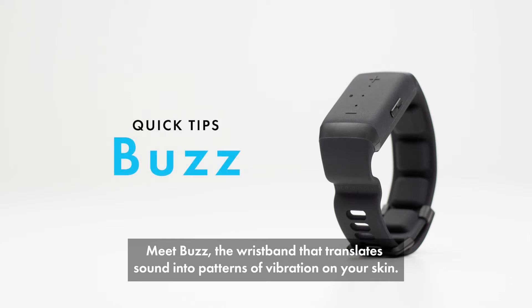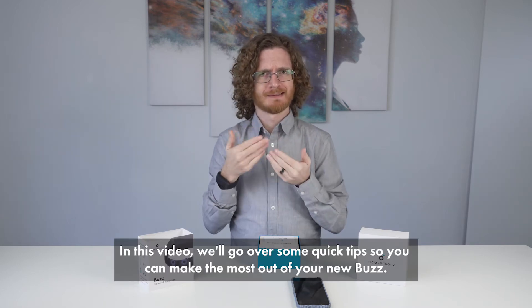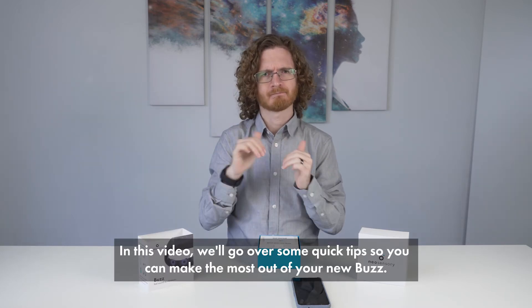Meet Buzz, the wristband that translates sound into patterns of vibration on your skin. In this video, we'll go over some quick tips so you can make the most out of your new Buzz.